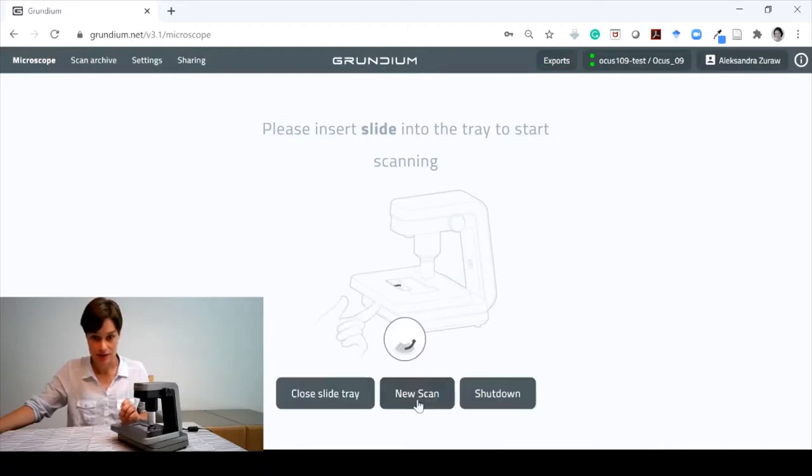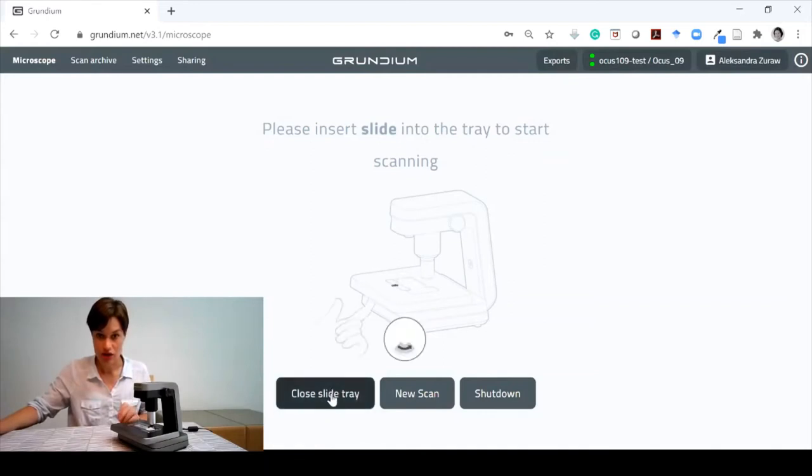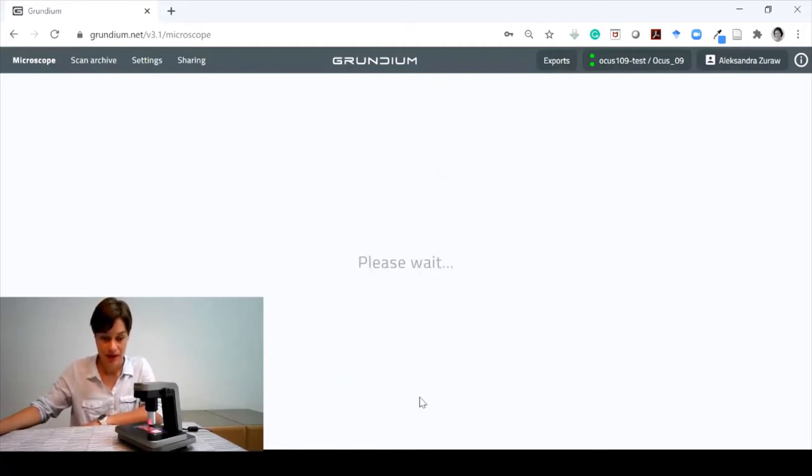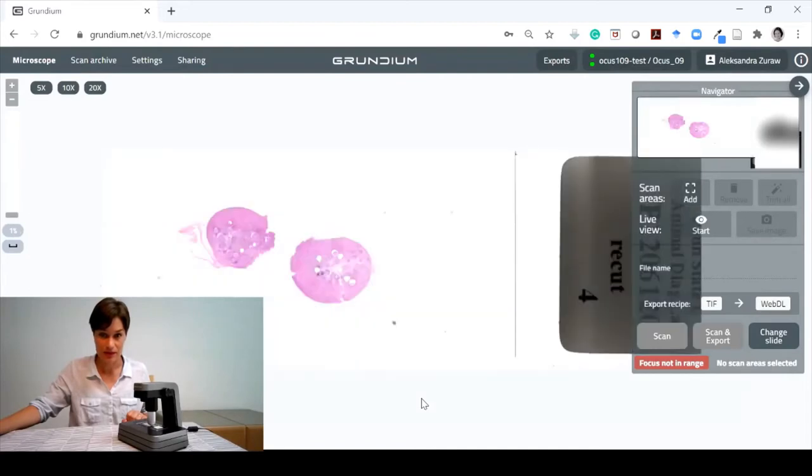I can eject the slide tray. It tells me to pull the lever below to open the slide holder. I put the slide in, close it, and I can do a new scan. I don't want to just close the slide tray, so I do a new scan. The first thing it's doing is taking an overview picture of the whole slide, and it's going to show this to us. We have here two pieces of tissue. This is an adrenal of an opossum.